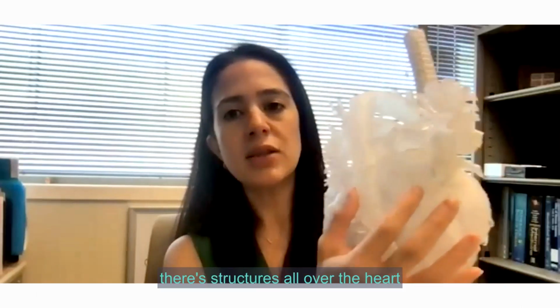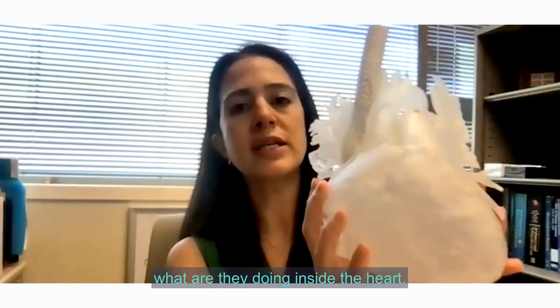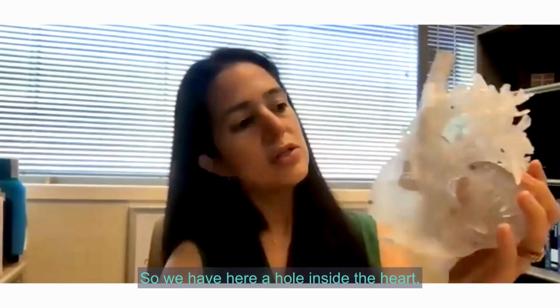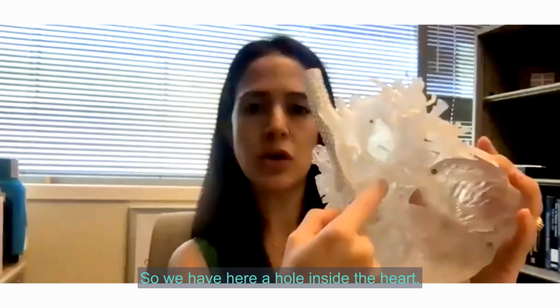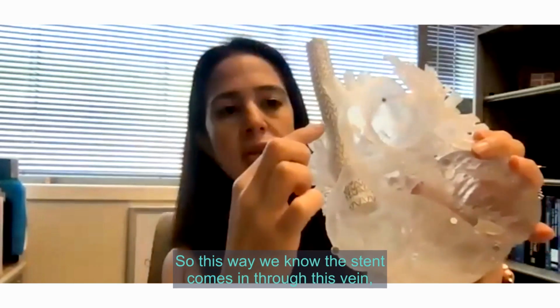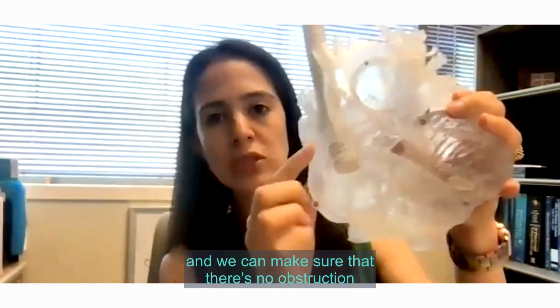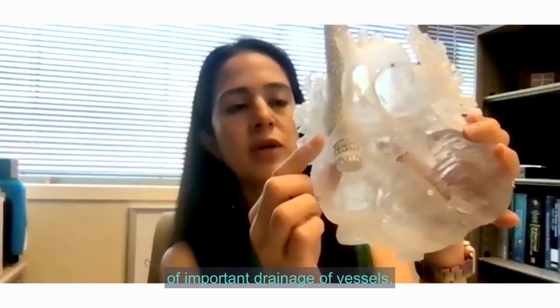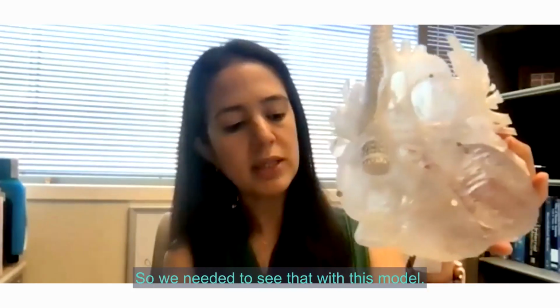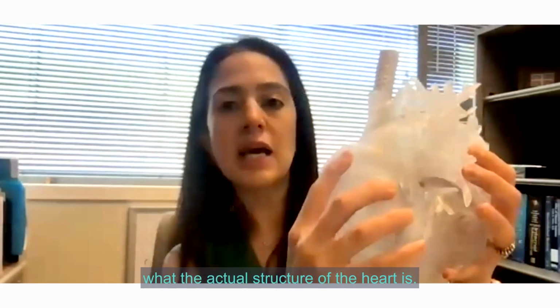As we can see, there are structures all over the heart, and it is very hard to know what they are doing inside the heart. So we open this up, and we can see how that looks. Here we have a hole inside the heart, and the veins come in abnormally right there. This way we know the stent comes in through this vein, into the heart, and we can make sure there's no obstruction of important drainage vessels, but also that it is going to fix the issue, make the patient feel better and avoid a surgery. So we needed to see that with this model. Otherwise, it's pretty difficult to assess what the actual structure of the heart is.